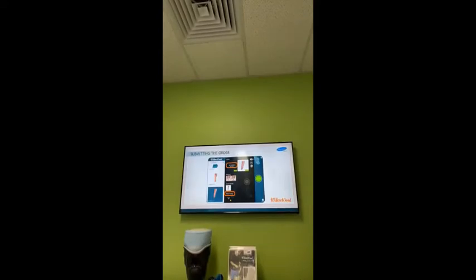So we saw how we are submitting the order from the screen. It's a handy tool to have all the photos and information in the one spot when you're submitting, compared to some of the other free apps where they're just a scanning app and they're not specifically written for the prosthetic and orthotic industry.